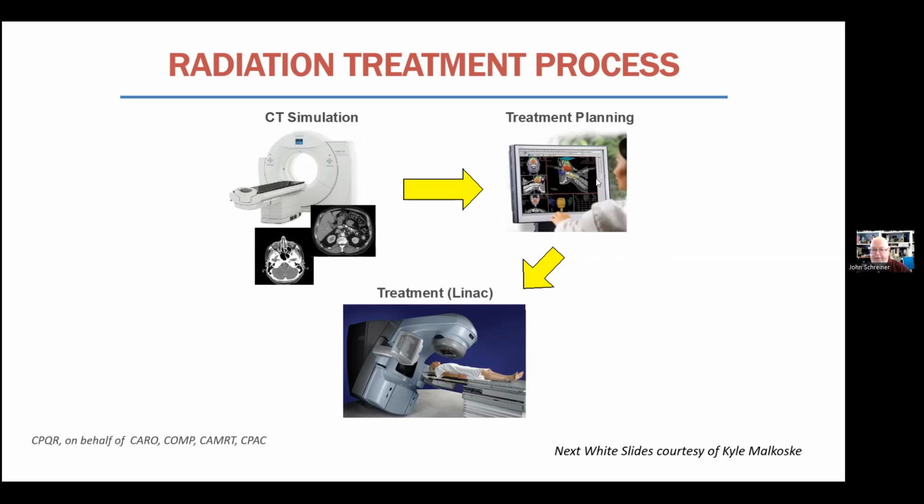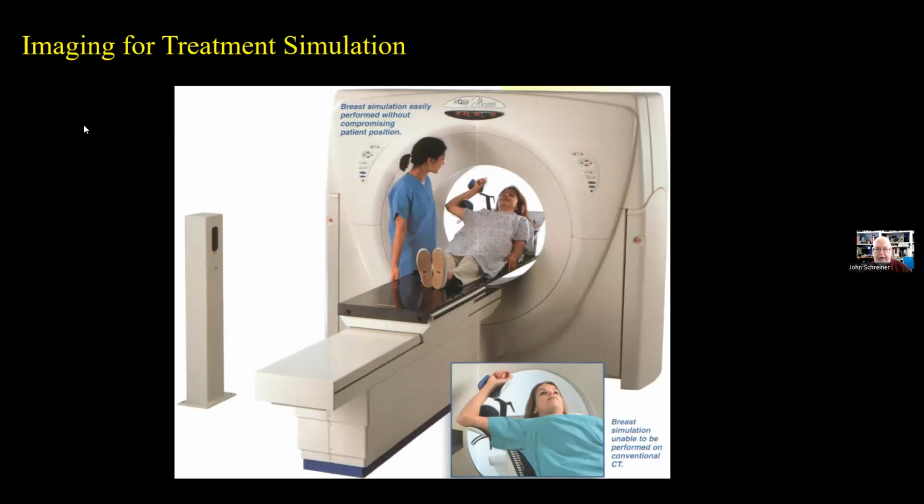And again, the physics team is integral to make sure that this is all happening appropriately. And we'll talk about that in the next few slides. So again, this is a CT scanner. This is a rather old image. They look a lot nicer now, a little brighter, I guess, maybe.